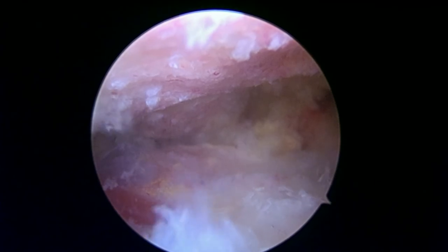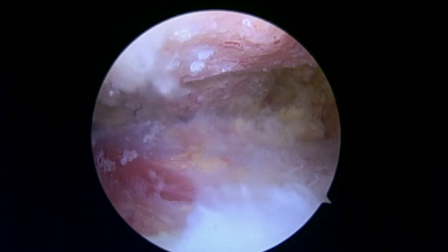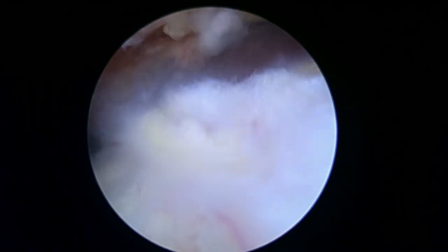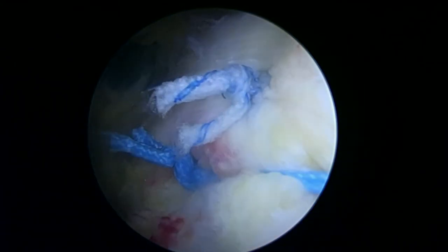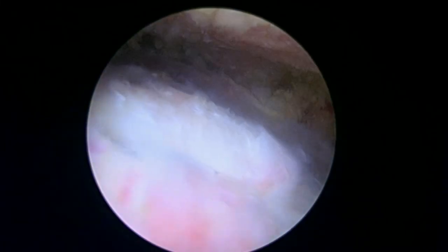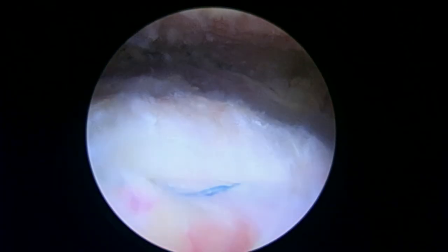Okay, we're all done here. Let me show you where we're at. As we look back here, you can see the knots that are tied. There they are right there. So there's the one ripstop stitch, and the second one is just parallel to it, just a little bit more medial, and I like the way that looks. Okay. And that's what we're gonna finish up with.